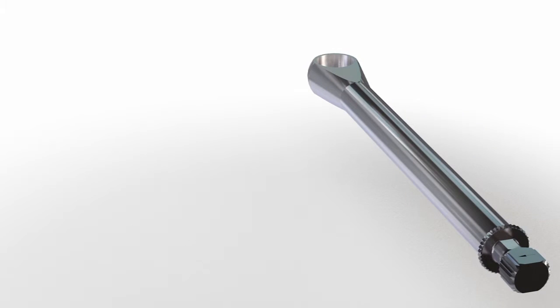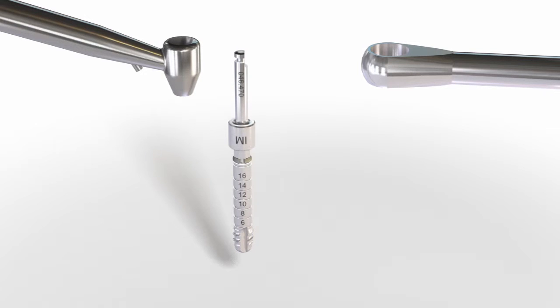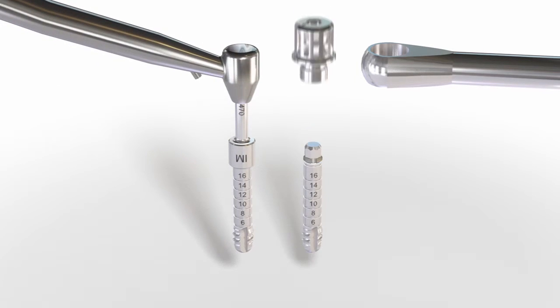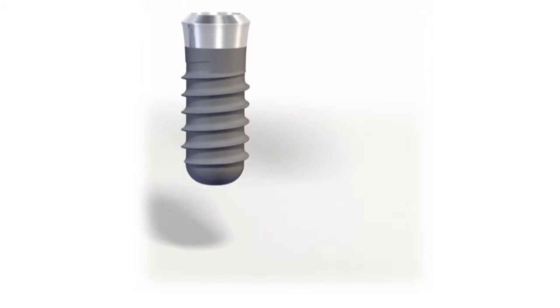Tapping is needed to prepare the implant bed for specific thread types. This is an optional step that provides the flexibility to adjust the surgical protocol to the bone class, and consequently, to achieve optimal primary stability. It is recommended in dense bone and with large diameter implants.